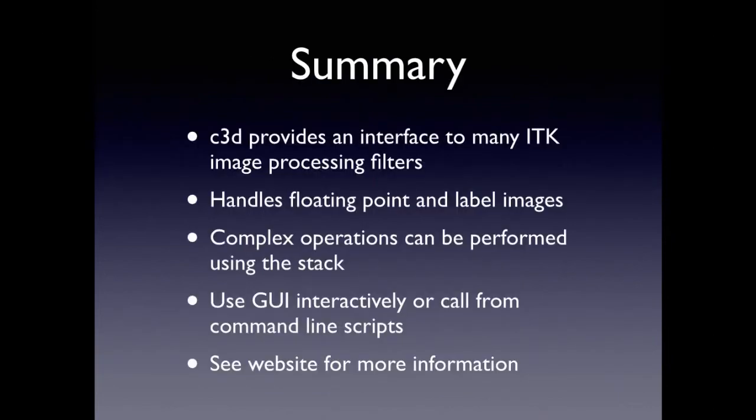It's all documented on the C3D website, and I would recommend going there and just even to look at some of the things that we've used to understand more about how those commands work, like minus thresh, and what their arguments mean. So just to sum up then, C3D gives us an interface to many ITK image processing filters. And these are pretty good, well-validated ITKs. They're a pretty nice toolkit, and C3D gives you a usable interface to a lot of it that you would otherwise might need to program C++ to get at.